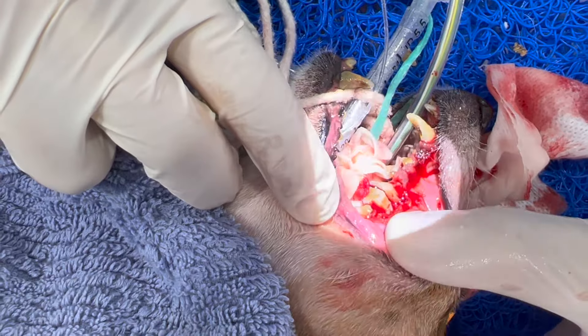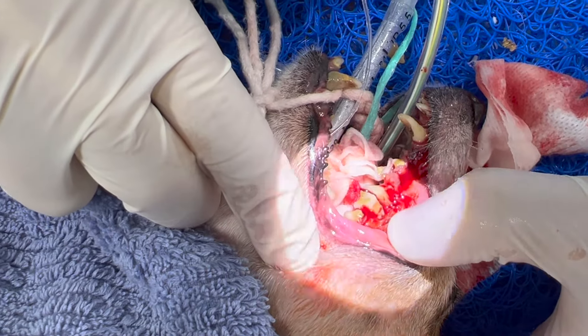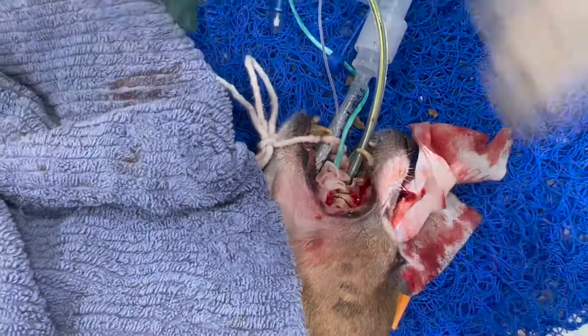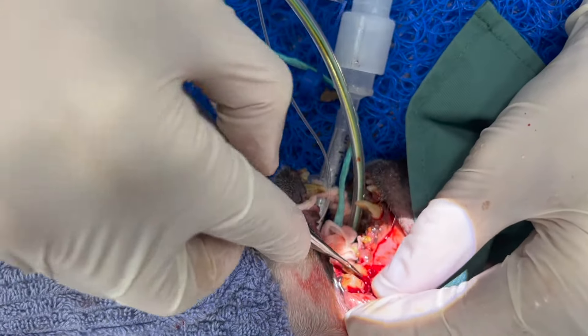The root has been cut — there are three roots but I've cut it into two sections. I've also burred away some of the bone, and now we'll start taking out the roots individually one by one, after gently elevating them.